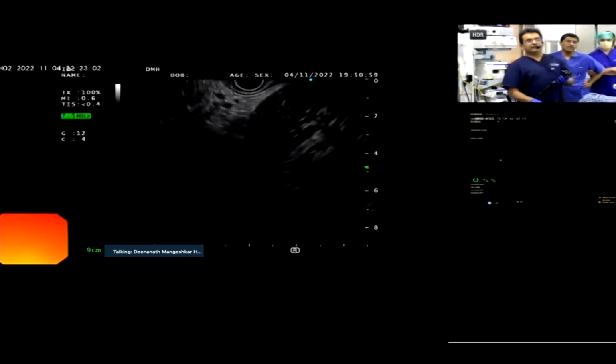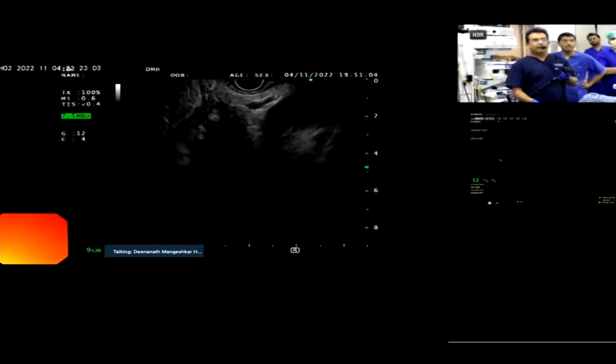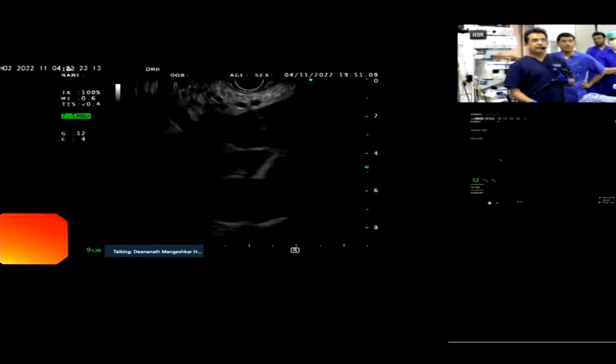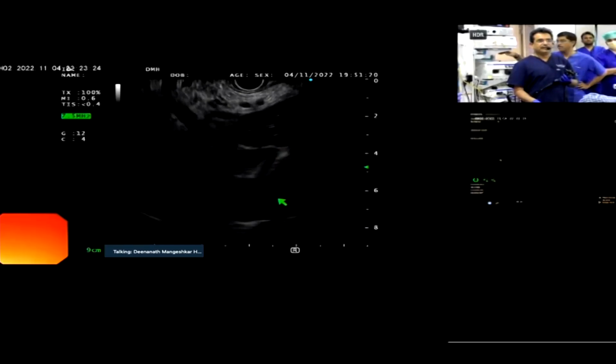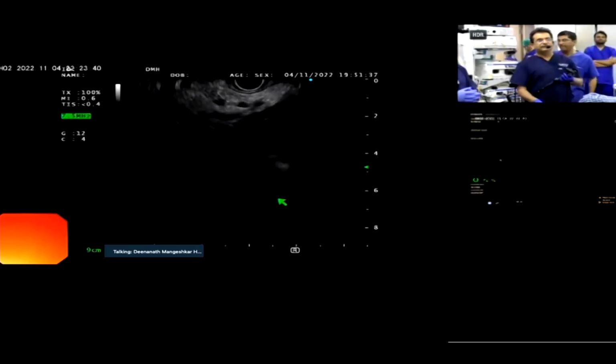So this is the left lobe of the liver in the neutral position, and now I start rotating clockwise until I see the porta. Now this is the porta, which we can see the portal vein and the bile duct, dilated bile duct behind that. And we can see that the bile duct is quite dilated. Maybe Harshal, you could just measure that in a moment. It's about 21 millimeters. You can see it's grossly dilated. Right. We can unfreeze and we can see.